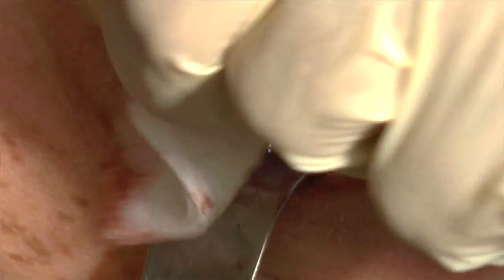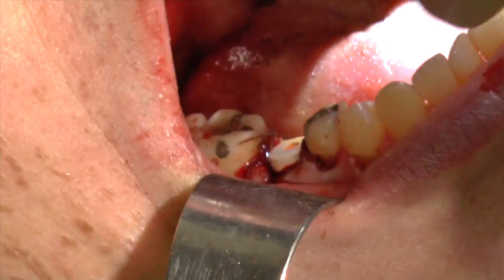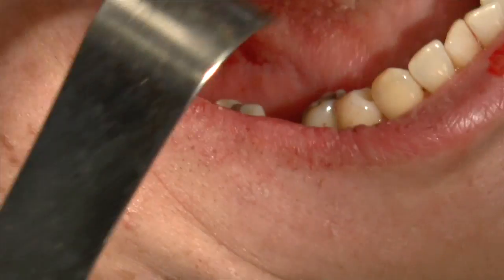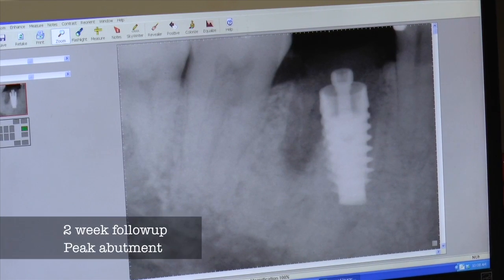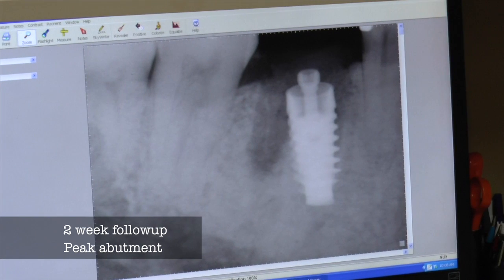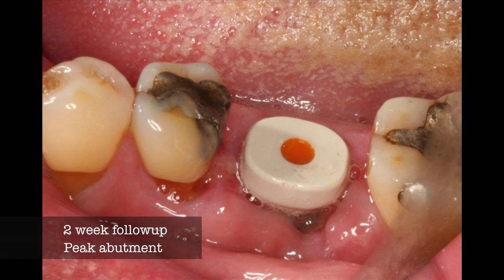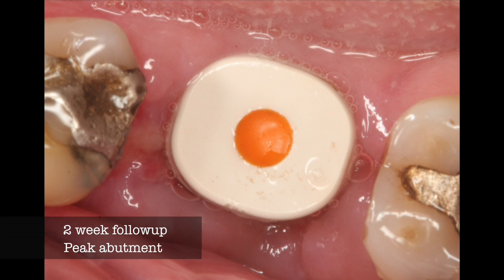We're going to bring the patient back in a couple of weeks, take an x-ray, and have a look at this particular abutment and implant to see how it's healing. Look at this x-ray — you can see the bone is already starting to fill in, and this is in the perfect place. The nerve is way down in this particular case, and we can see the soft tissues are starting to heal, with the implant in a nice place for future restorability.